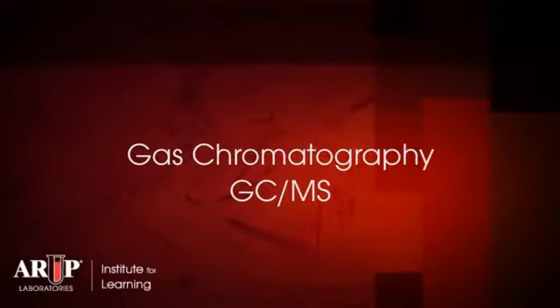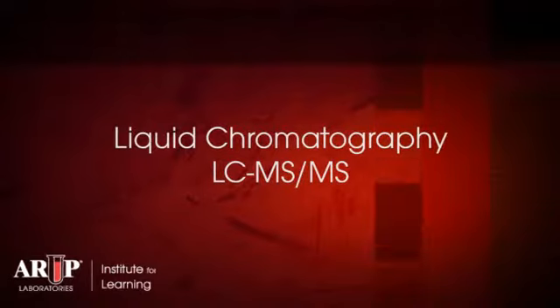In drug testing, a common combination of chromatography and detection is GC with a mass spectrometric detection, or GC-MS, or liquid chromatography, LC, coupled to either single-stage mass spec or some other type of mass spectrometer. In general, chromatography coupled to mass spectrometric detection is going to be much more specific than an immunoassay.